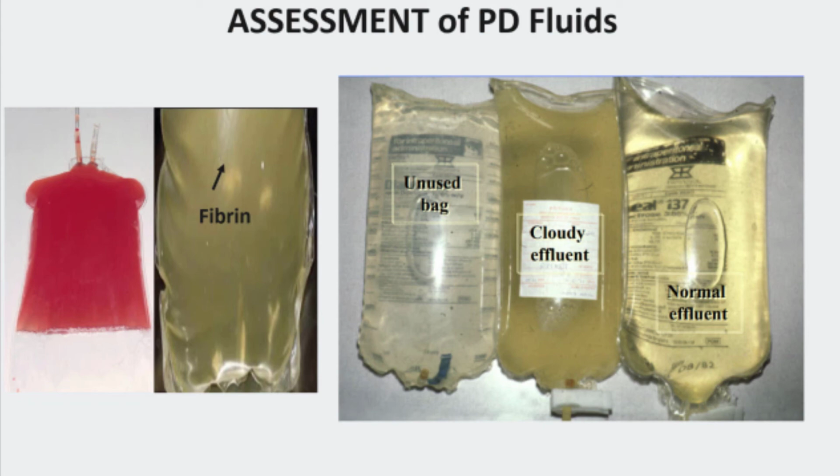Fibrin will appear in fluids like floaters or have a jellyfish-like appearance. Patients with fibrin in their fluid should have heparin added in their dialysates for the next treatment in order to prevent their catheter from clogging. The dialysis nurse will take care of this.